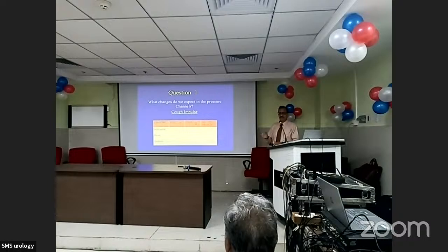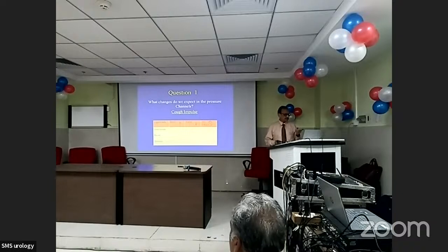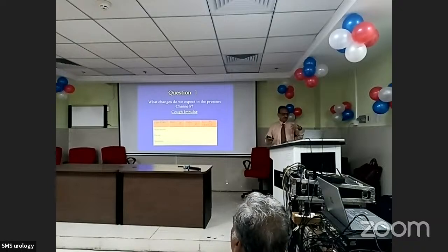And then whenever you have these lines, if you can answer these questions quickly: what changes do you expect in the pressure channels? For example, a cough impulse. When your channels are perfectly well positioned, the patient coughs.